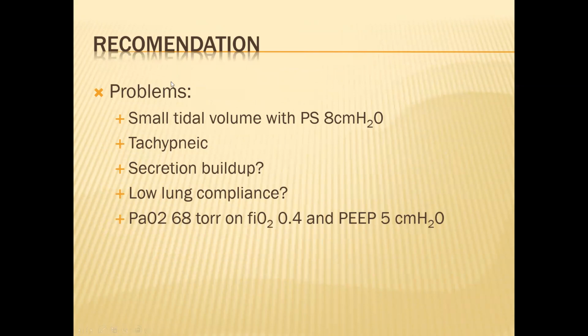All right, so problems, it says small tidal volume with pressure support of 8. We identified that. Patient is tachypneic, we identified that. Could it be because of a secretion buildup? That could definitely cause a lot of VQ mismatch. What about low lung compliance? Is that possible?